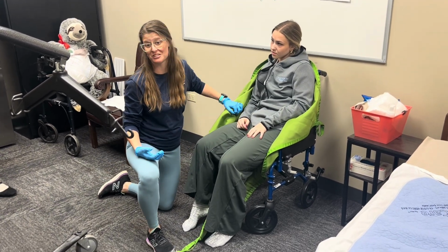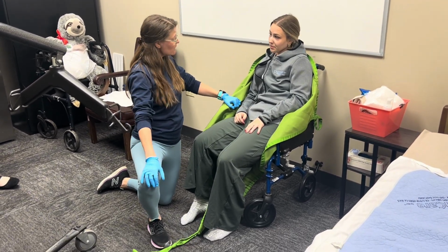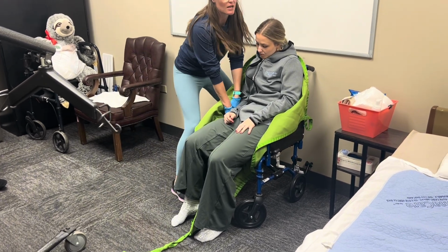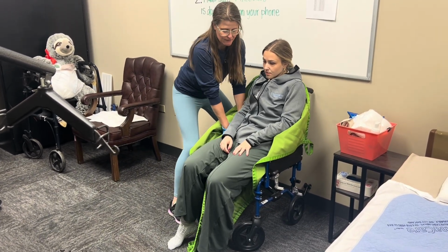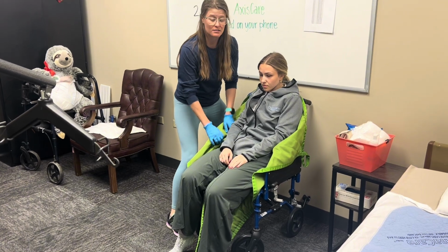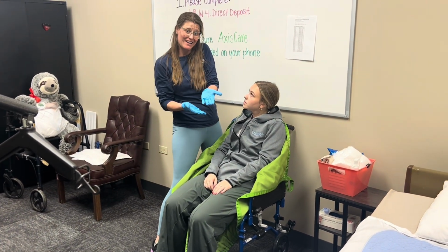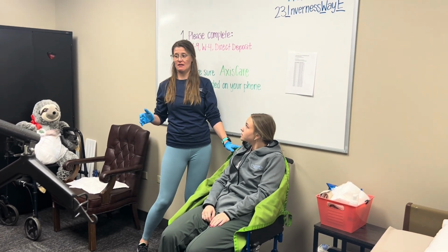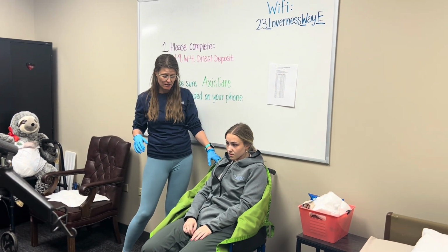One, Michaela's positioning is really poor in this wheelchair. Are you able to assist yourself, or do you need me to help you? I need you to help. Okay. So what I can do is just bunch and grab the Hoyer sling and shift her buttocks. I noticed that she was sitting on the side and couldn't do that herself. So this is okay. It's not preferred for our clients to sit in the chair with the sling.